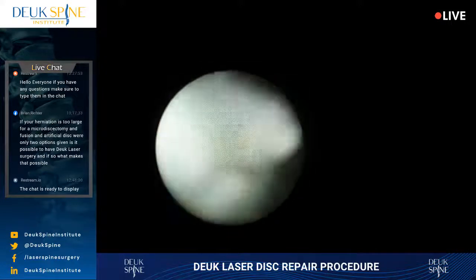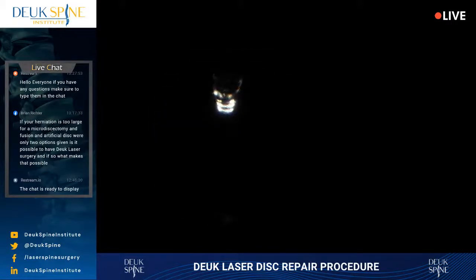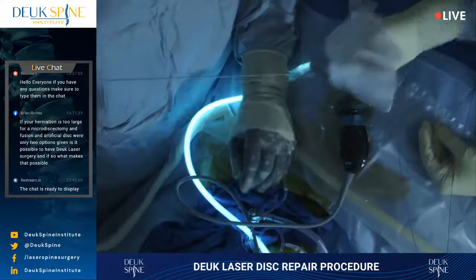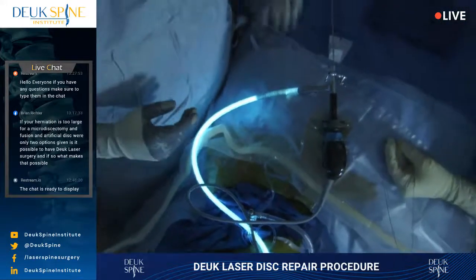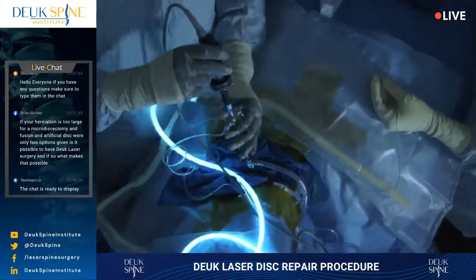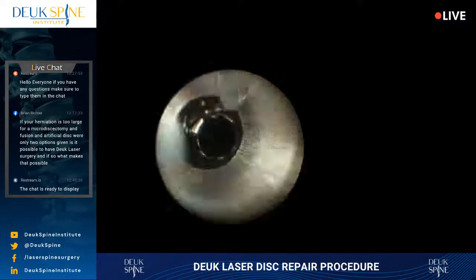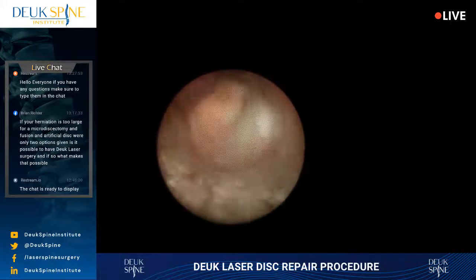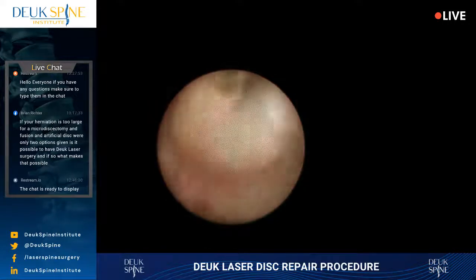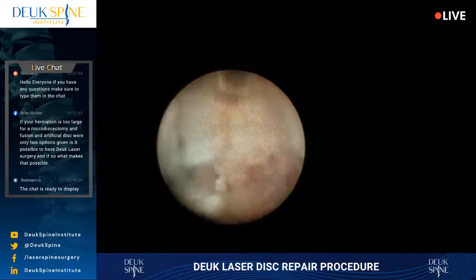Oh yeah, wow. That was a blow up. So that is the herniation. And it's big. It's in many pieces. So we're not going to get it all with just one. There's another big piece. But you can see this is a process. It's not one and done. Get in, grab it, get out. You got to get all the pieces out. I've been doing this long enough that I know 99% of the time there's many pieces, more than just one. And I got to get them all, or the patient won't be fixed all the way.